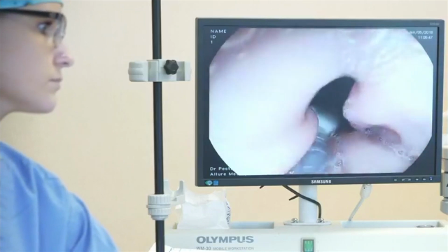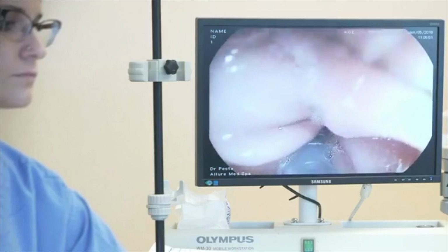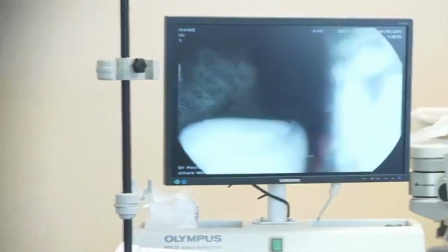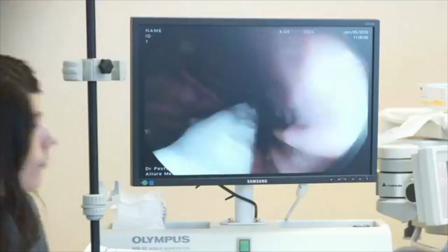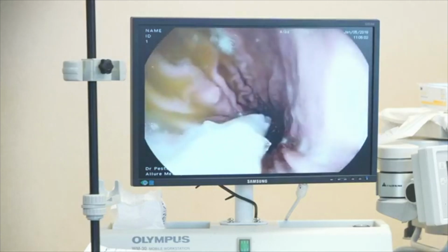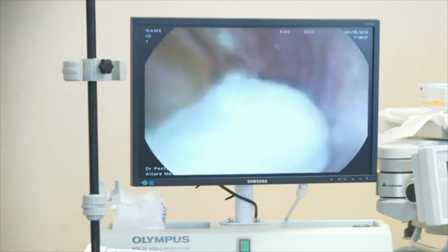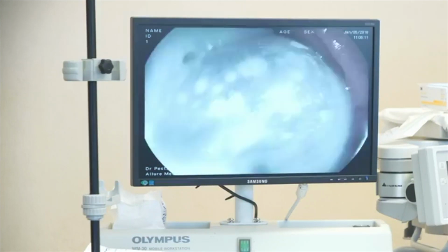We're connected to our pump. Now the pump makes a little noise as it's inflating. And then we're able to monitor and watch the balloon as it inflates within the stomach. Okay, we're going to activate our pump. If you can just step on that, we'll go up to 600. So you can start to visualize the balloon as it's expanding within the stomach. You see it start to fill with fluid.